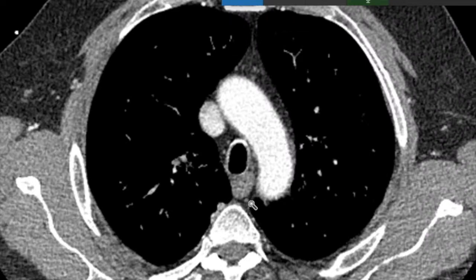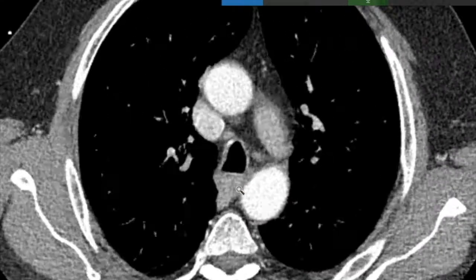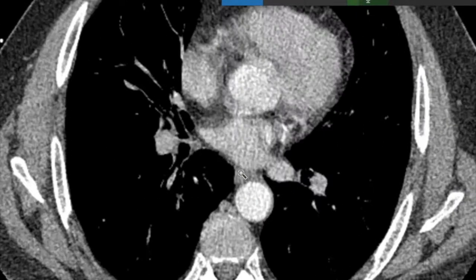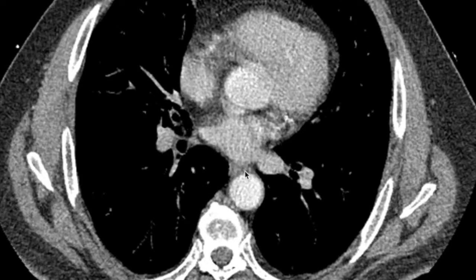Just to demonstrate the anatomy: here's the esophagus — we're going to put the scope down into the esophagus. The first landmark I look for is the left atrium because it's quite easy to find, sitting anterior to the esophagus. So there's the esophagus and here's the left atrium. With the scope sitting here looking anteriorly and seeing the left atrium, I'm then going to rotate the scope around to the left until I find the descending aorta.